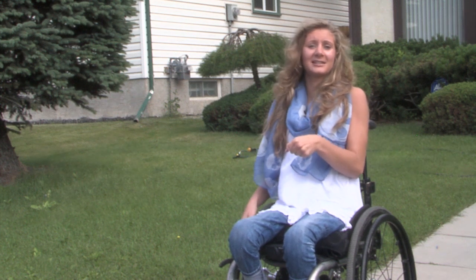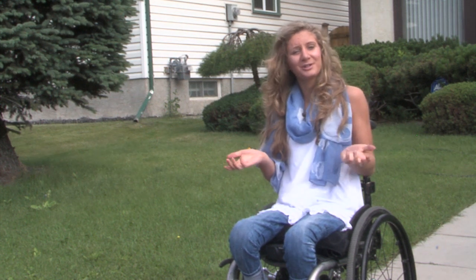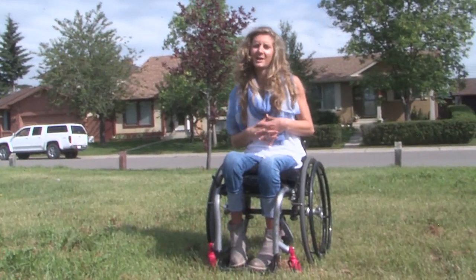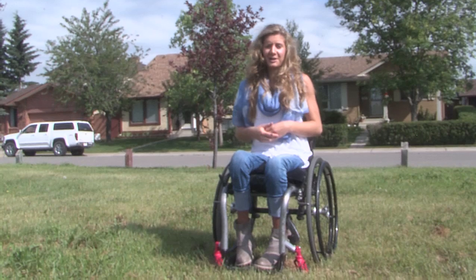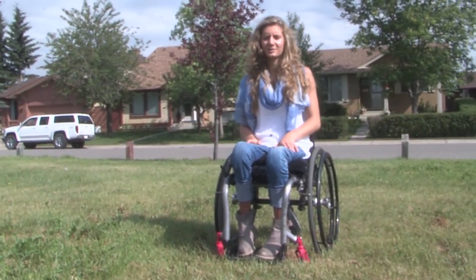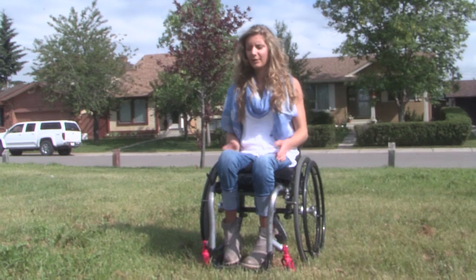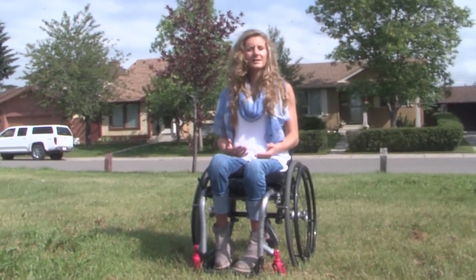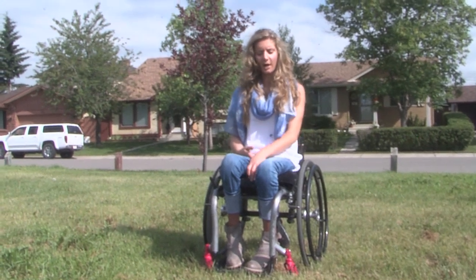I can hold on with one hand, steer with the other, and the SmartDrive will get me where I want to go. When I used to come to the park and play fetch with my dog it was always a workout — you have to struggle to get through the grass and different terrain that's not smooth like sidewalk — so it was always a little tiring on my arms.